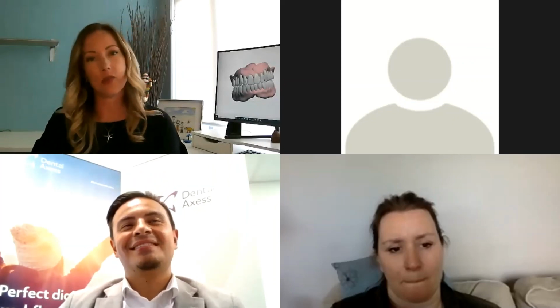This is what I get most excited about, and I think the enthusiasm gets carried on to the patient, because when I meet Mr. Parsons, I'm like, this is going to be amazing for you, and I could show them that, and they believe it, and we make it happen. And I could see that, because I've seen when you've shown it to patients when I was in your office a few times, and I know you're showing them a smile design, and I get excited when I see them.